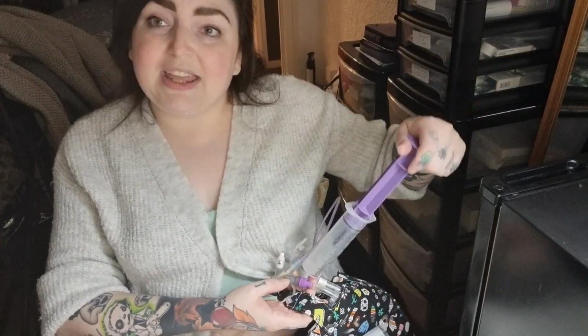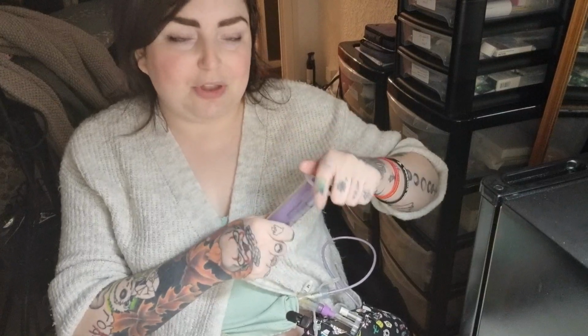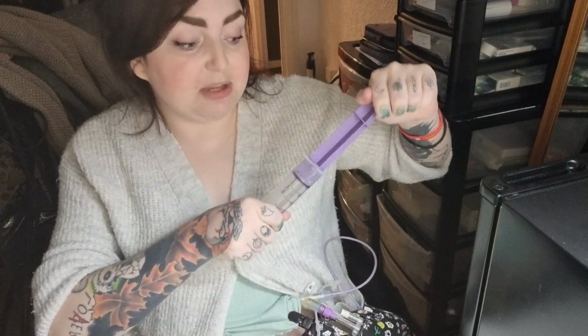So next step is just waiting for this to fizz, sucking it up into this big syringe, which is a 60ml enteral feeding syringe. And then I'll need to pause the feed, and then whack it into the jejunal hole, push it all in. It doesn't go that fast, because obviously you're just putting it through nice and easy. Sometimes actually it's quite good to pump it in. I'm not sure why, I think it swirls around in the tube or something, they said.